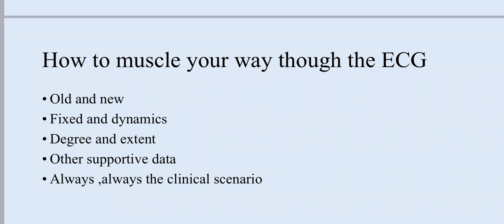Other supportive data is again important, and by supportive data, I mean chest X-ray, the bloods, the clinical exam, of course, and echo. Sometimes the only way out is echo. Always the clinical scenario, okay?